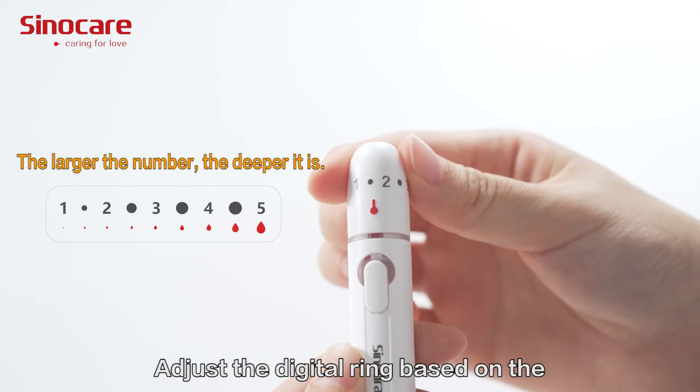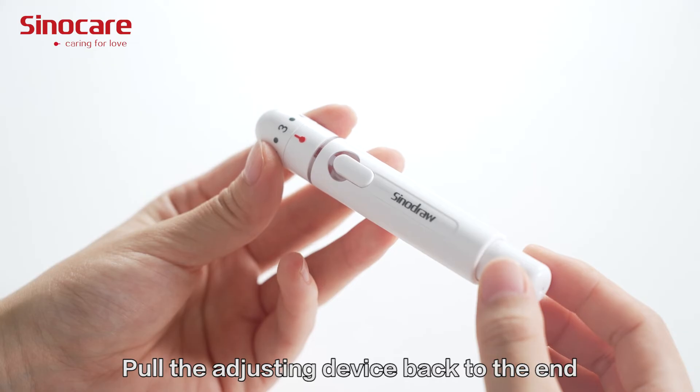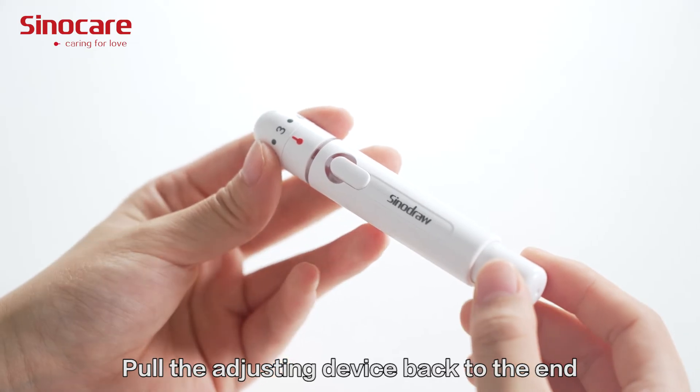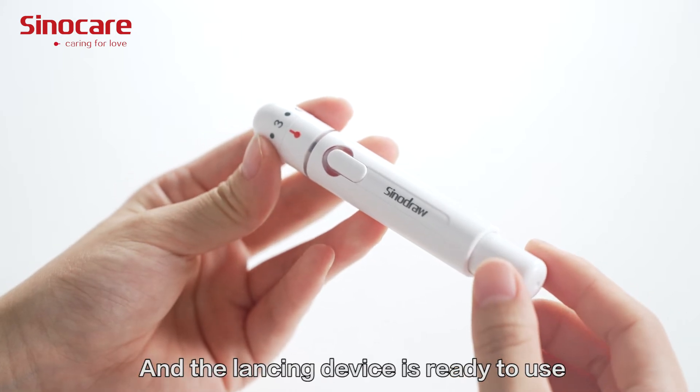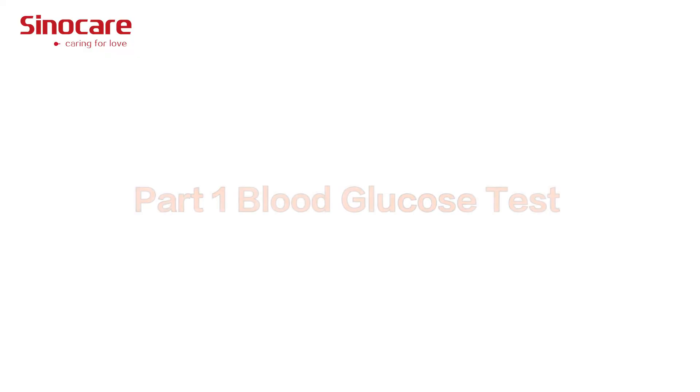Adjust the digital ring based on the skin condition of the patient's fingers. Pull the adjusting device back to the end. The spring loads back automatically, and the lancing device is ready to use.